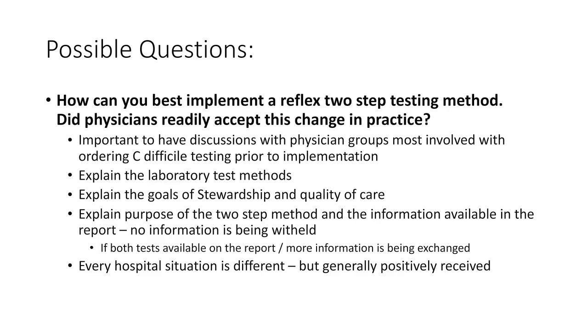We explained what our laboratory test methods were and what we were trying to accomplish by our methods. We explained the goals of stewardship and that really the prime goal of all of this is quality of care. We explained the purpose of the two-step method and the information available in the report. No information is being withheld. If both tests are being run, they are available on the report, and we're saying that it's really more information than they ever had before. But I have to say, every hospital situation is different, but generally this has been positively received.